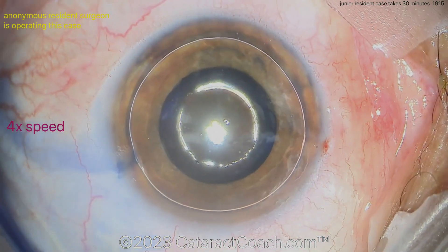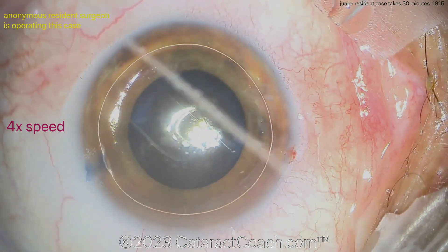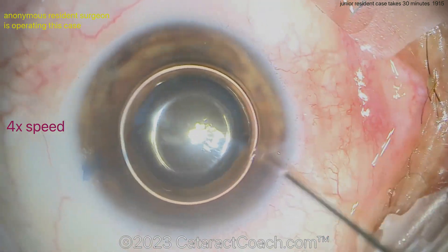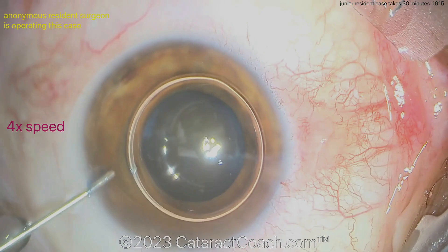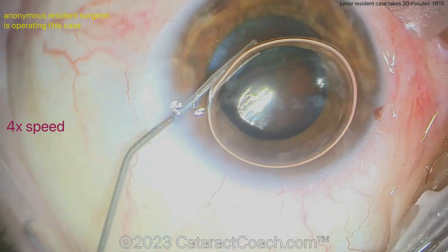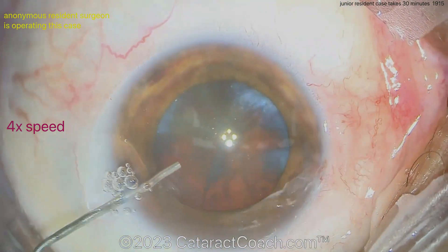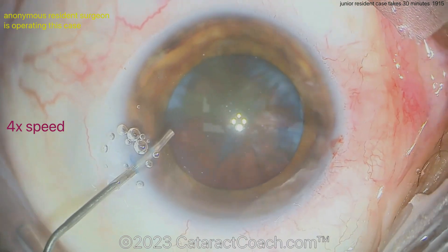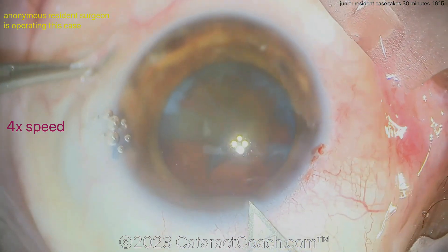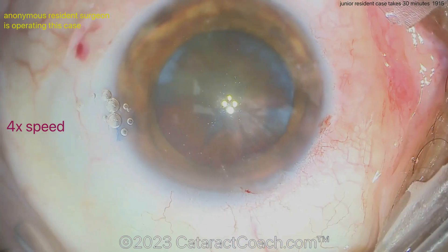First, let me say: yes, it's perfectly fine if you're a junior resident and your case takes 30 minutes — that's okay. There is no rush. What's more important is that you have good technique throughout the case. Don't ever be concerned with speed, whether you're just starting off or even later on. I'm not concerned with speed in my own cases at all. It takes the time it takes. I'm concerned with how precise, how pretty, and how safe the case is — those are far more important.